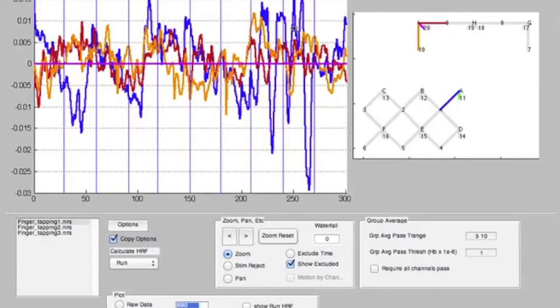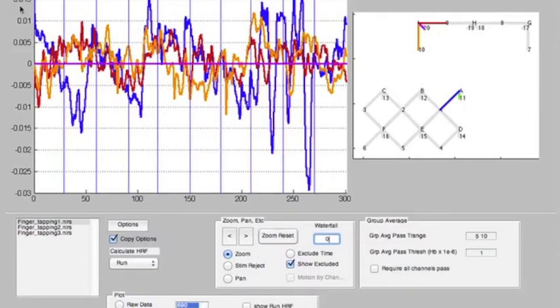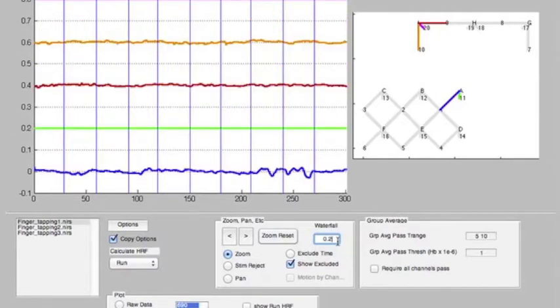Another way you can separate these channels and make them easier to view is to use the waterfall plot. Here we enter a number on the scale indicated on the data plot. Let's choose 0.2. This now separates the channels of data by 0.2.